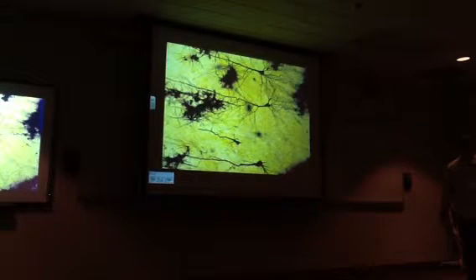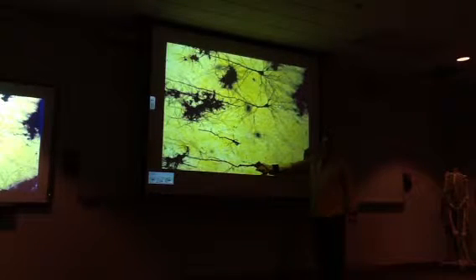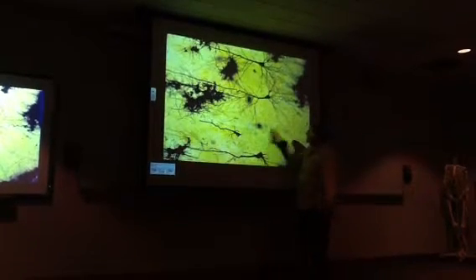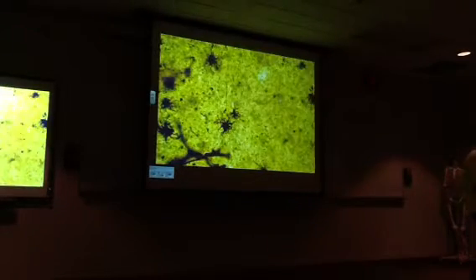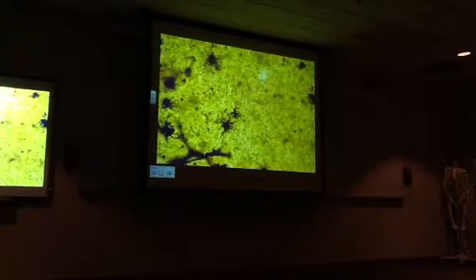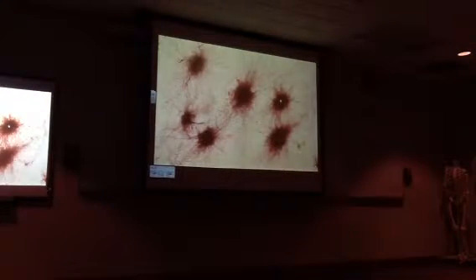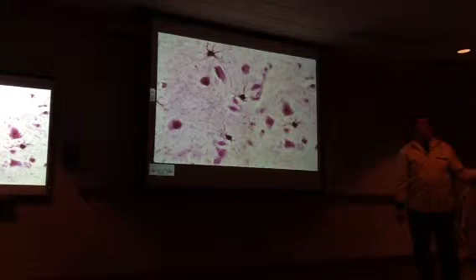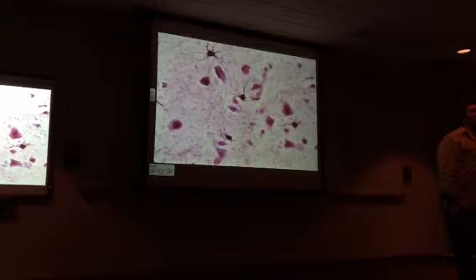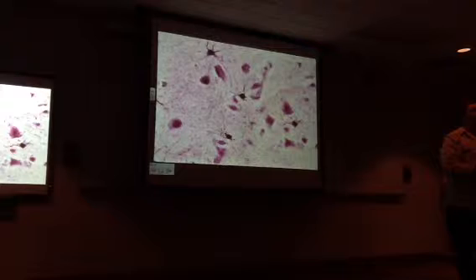This one is not such a big deal. It's just to highlight these cells, the pyramidal cells. Okay, and these are the dendrites on the pyramidal cells. That's not something that's that important. And all these astrocytes, we're not going to ask you to identify the astrocytes. You know that you would have fibrous astrocytes versus protoplasmic astrocytes. Protoplasmic astrocytes are associated with gray matter. Fibrous astrocytes are associated with white matter.